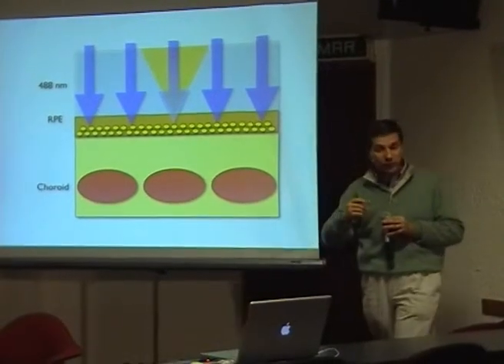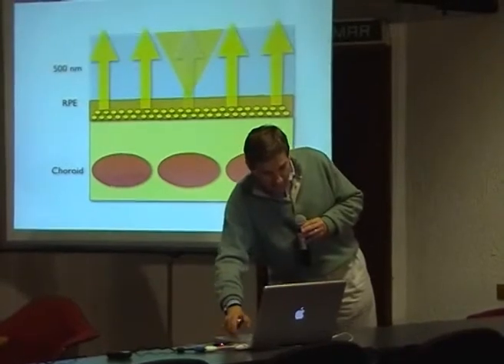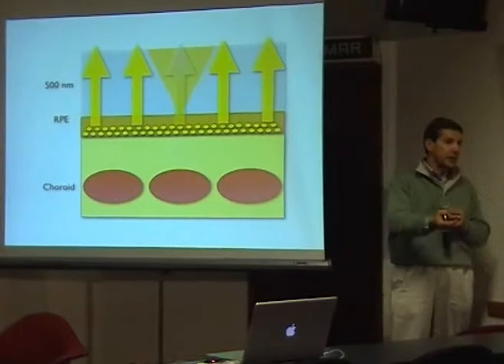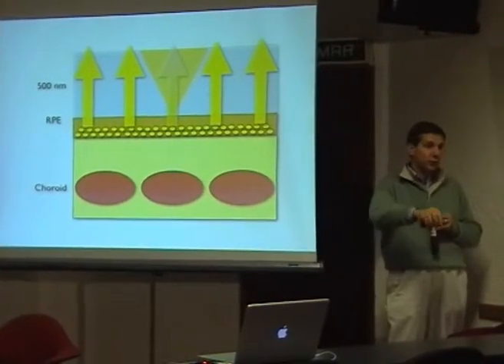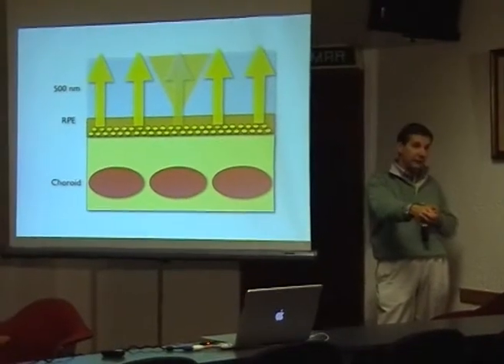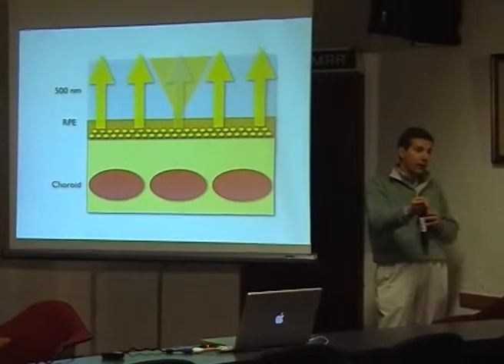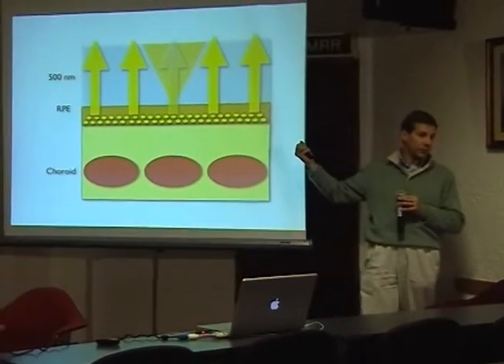And you use as a barrier filter a wavelength that is about 500 nanometer. So it is exactly the same that we use for fluorescein angiography. So practically, if you take a filter, excitation and barrier for fluorescein, you get an autofluorescent image.